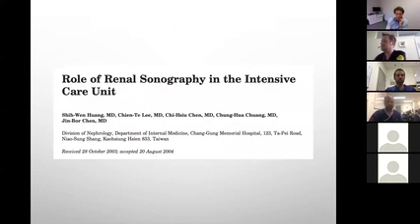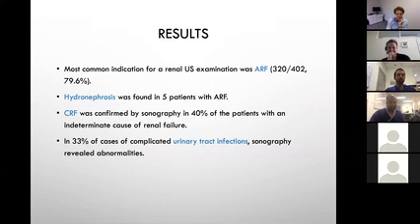When I looked last night, I came across this paper, not a great paper I should say, but it gives us some perspective of what ICU would potentially want to know when it comes to renal-related pathologies. It's, I don't know, Chinese or something like that. It's a retrospective study. They looked at 400-plus patients, went back and checked who had a renal ultrasound and the reason why they were doing it.